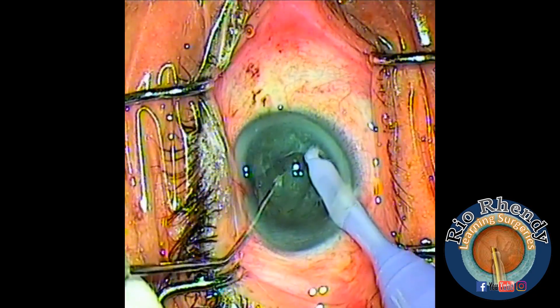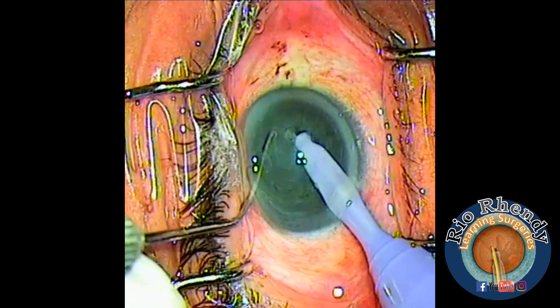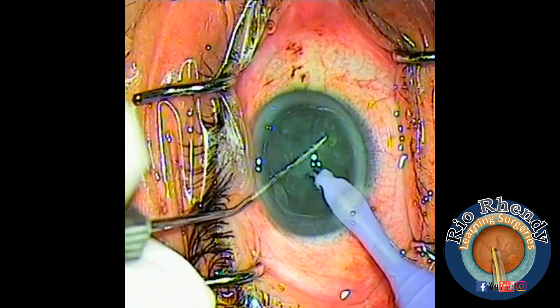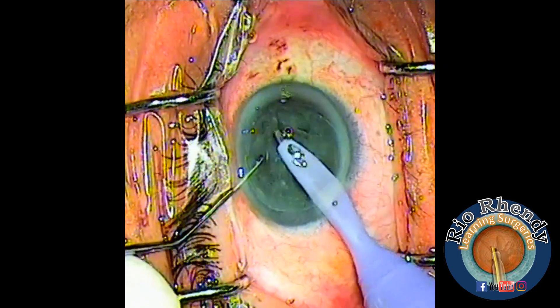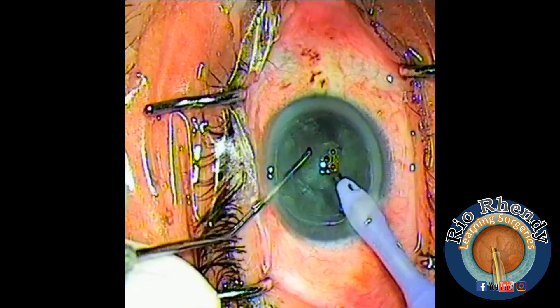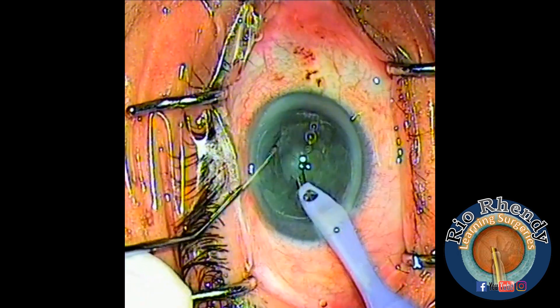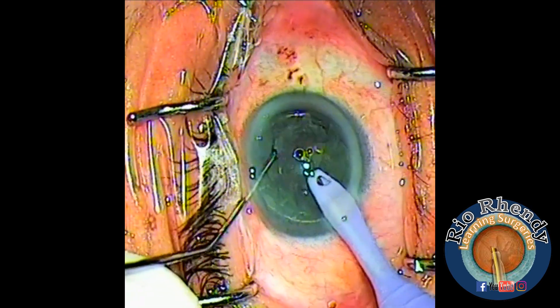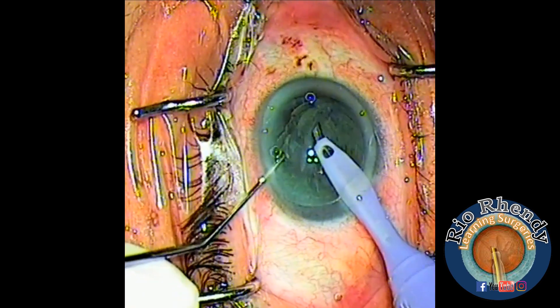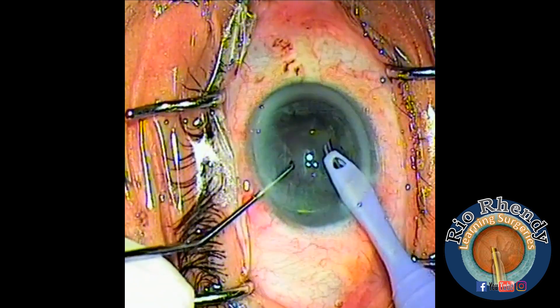I introduce the second instrument from the side port. Now I'm going to make an impale chop — it divides into two parts. I make another chop to make it smaller and rotate the lens. In soft cataract, it's sometimes hard to impale the lens, so hydrodelineation helps — you can emulsify all the nucleus first, then continue emulsifying all the epinucleus.